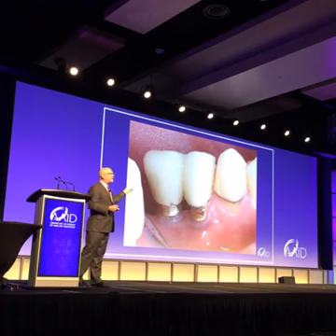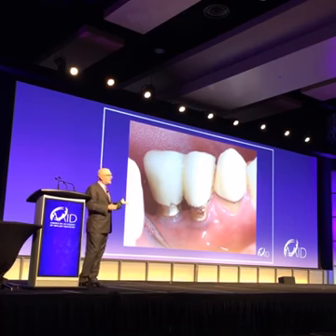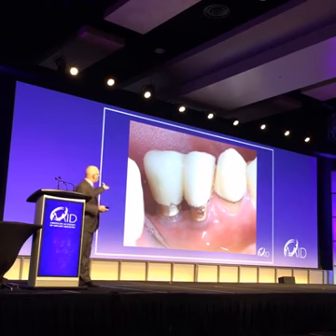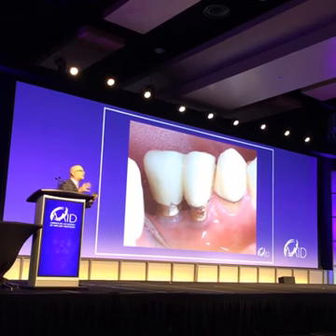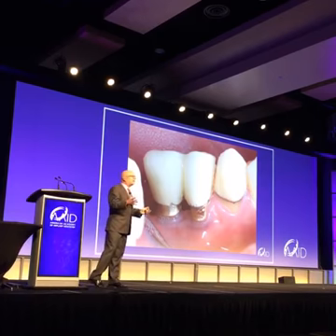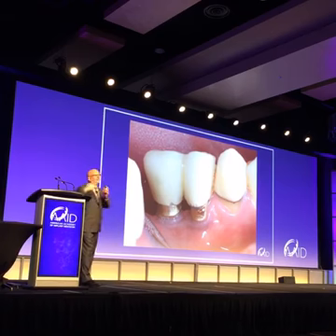Last year I called the GP office to see how he's doing. He still has the implant. It'll be like 3 years down the road after I did the initial treatment, and the implant's still there, as opposed to just taking it out. We don't have to take everything out, give it a chance. The worst case scenario is if it didn't work, it would have come out anyway. So I couldn't be further behind by trying the LAPIP protocol first and then seeing what happens.